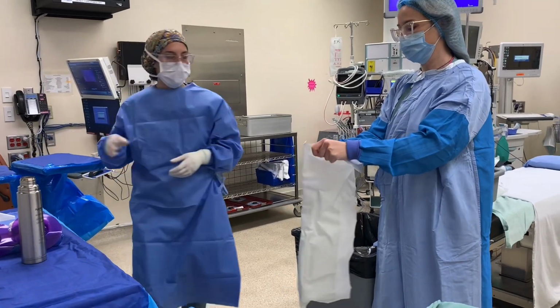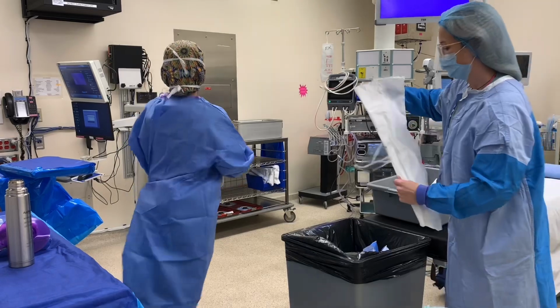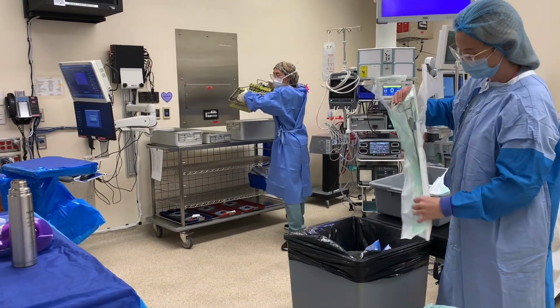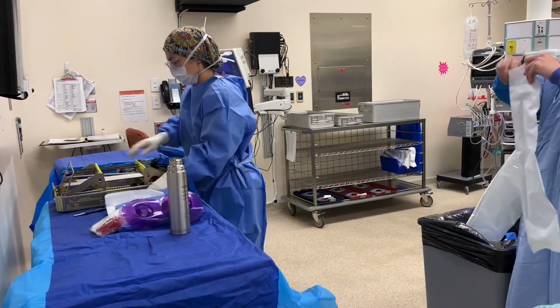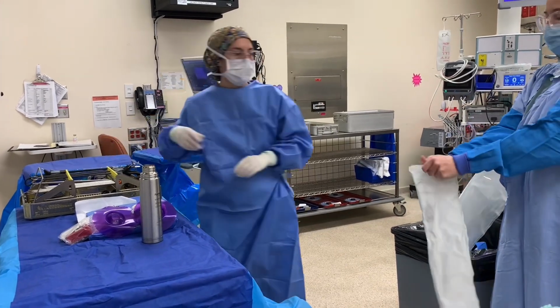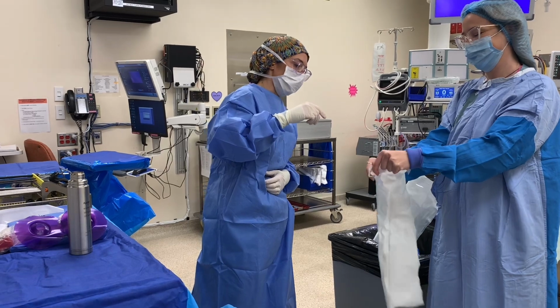Sterility and integrity shall be maintained when opening, dispensing, and transferring items to the sterile field. Expose contents so the scrub can remove the item from the wrapper. Of course, we know never to reach over a sterile field or shake an item from its package. By dispensing items directly to the scrub nurse, this reduces any risk of us doing that.